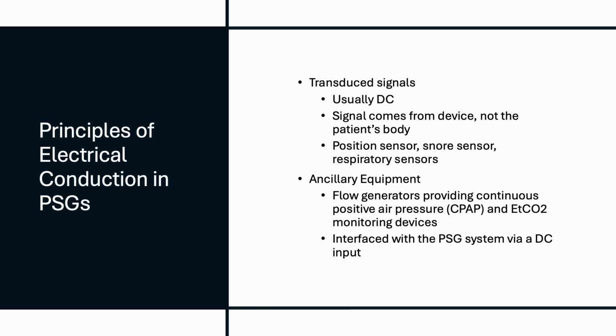Very quickly, DC stands for direct current. That means when the circuit is closed, you get one voltage all the time, and the same for when you open the circuit. It's zero. It's either on or off. AC, or alternating current, gives an oscillating on-off signal at a rate of 60 times per second, or 60 hertz. There are several reasons for the differences and where the currents originate from, but that's what you need to know for now. DC is on or off. AC goes back and forth at a rate of 60 hertz when the circuit is closed.